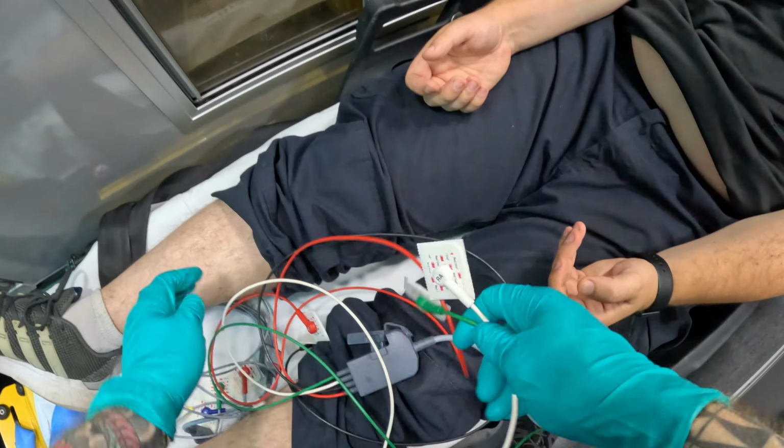So what I'm going to do is lift your chin up. I'm going to find this spot here called the manubrium. Let me lift your shirt higher. Right here, this is the manubrium. This corresponds to the second intercostal space, and I feel it. Second intercostal space. It's the hole between the two ribs.